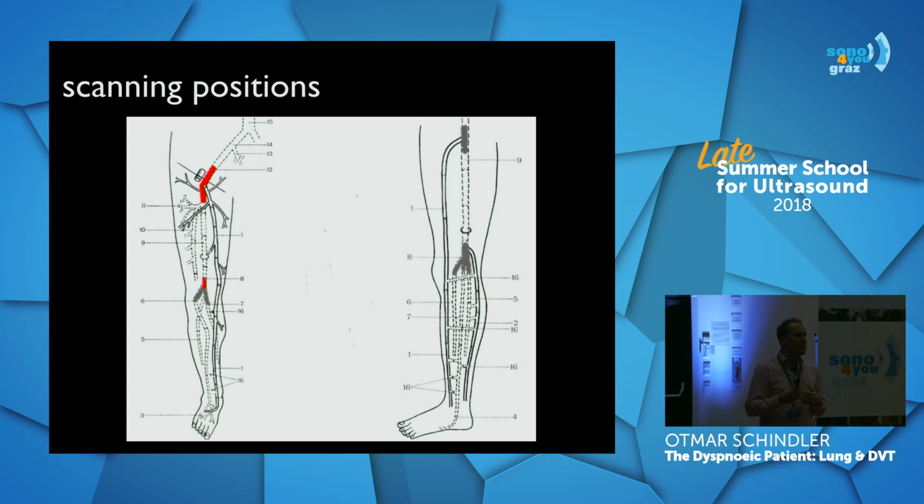How can we see pulmonary embolism? We can do a CT scan, we can do a V/Q scan, okay? It's not very handy in the emergency department. We just take the ultrasound probe, yeah? We do a scan of the heart. If we have a dilated right ventricle, that's a clear sign that there could be pulmonary embolism. We can take the probe and watch for small subpleural defects dorsobasally, that's the infarctions after the pulmonary embolism, so we also can see it with thoracic sonography, but that's not quite easy to find, and it takes a lot of time.